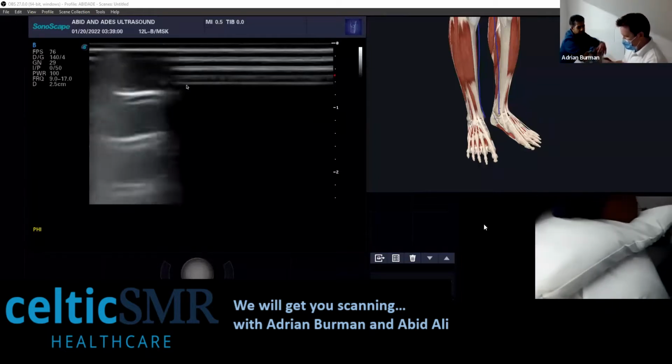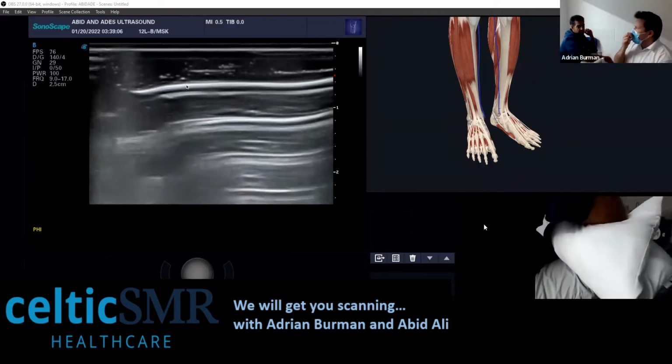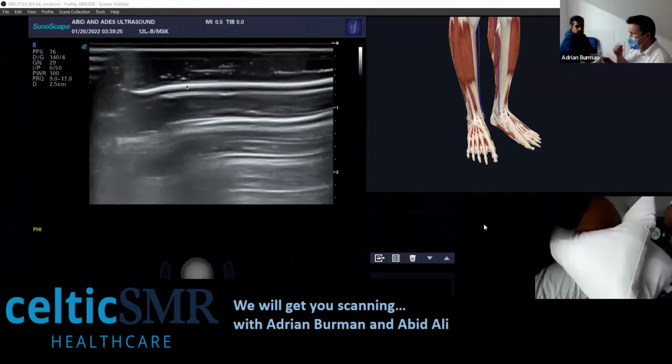So were there any key points that you just want to go over from those modules that you did of elbows? We did a series of 4, was it, for the elbow? Yeah, so sort of anterior, posterior, medial, and lateral, I guess. Yeah. I think those are the ones that we did. We broke them down into that. Not too difficult. It gets a little bit difficult when you're looking at the distal biceps tendon. That can be quite challenging for some people. But other than that, it's pretty straightforward exams to look at with the elbow.